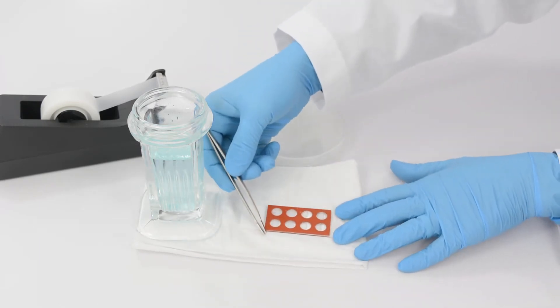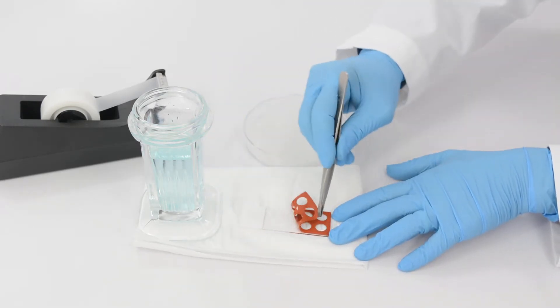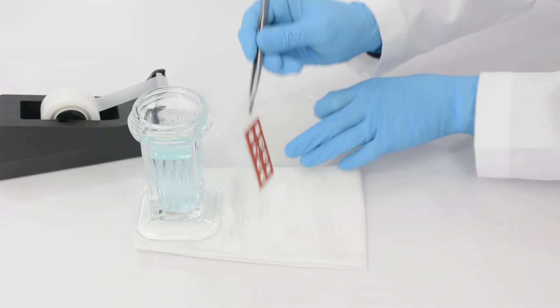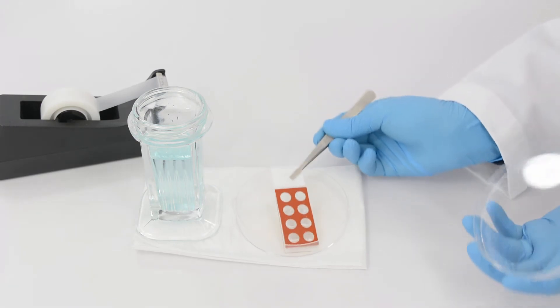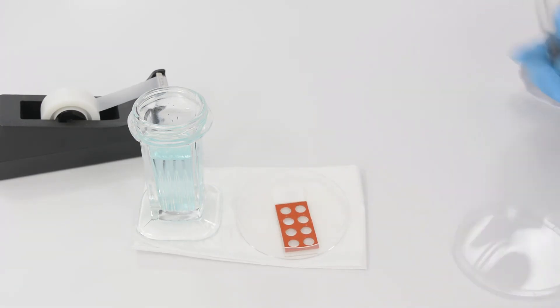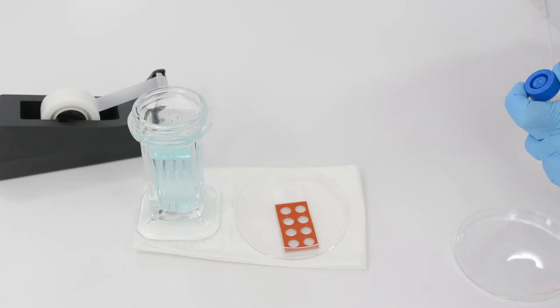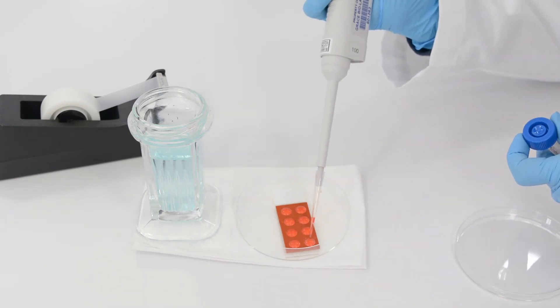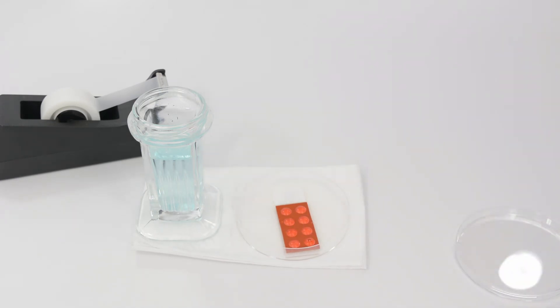The isolator will stay in place until removed. Place media into each well, and store the slide in a humidified chamber until use.